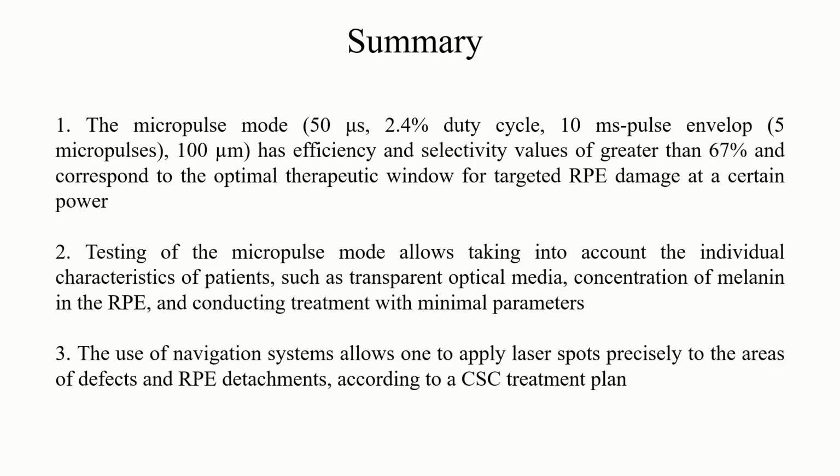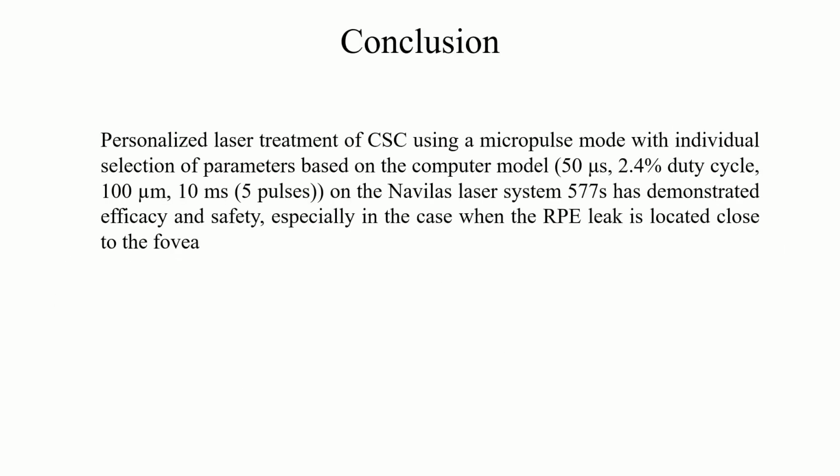The use of navigation systems allows one to apply laser spots precisely to the areas of defect and RPE detachments according to a CSC treatment plan. The conclusion we have come to is as follows. Personalized laser treatment of central serous chorioretinopathy using a micropulse mode with individual selection of parameters based on the computer model on the Navilas laser system has demonstrated efficacy and safety, especially in the case when the RPE leak is located close to the fovea.